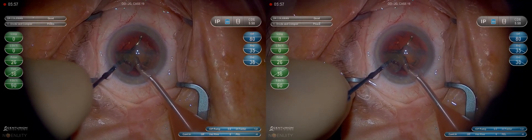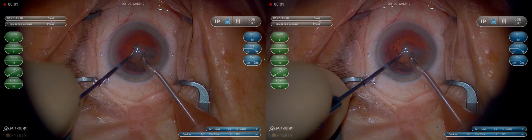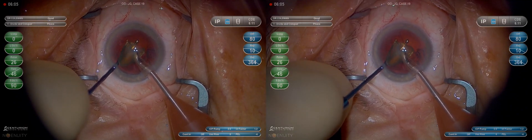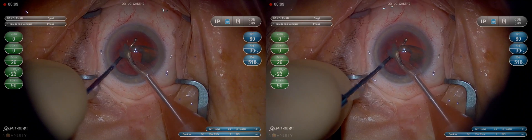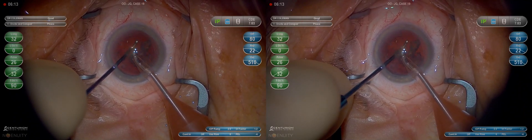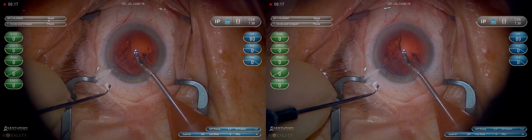That's the most efficient way to get the nucleus out. Now we're being a little more careful, protecting deep with our chopper. On the last quarter we need to slow down, get the chopper deep in the center, and make sure that the posterior capsule does not come forward. The last quarter is when we need to slow down and be the most careful to prevent a posterior capsule rupture.